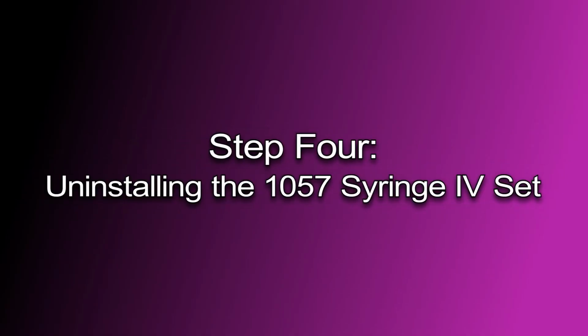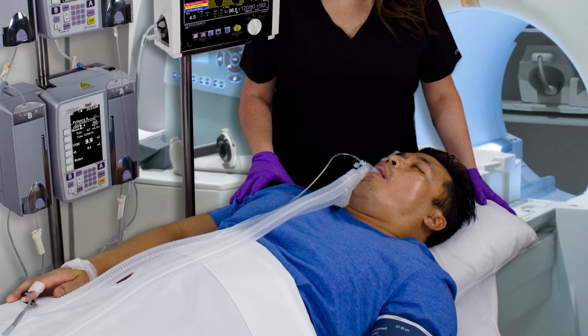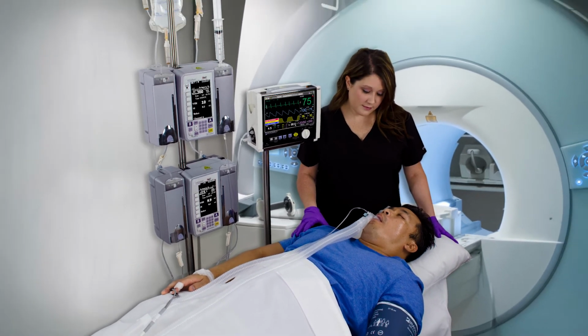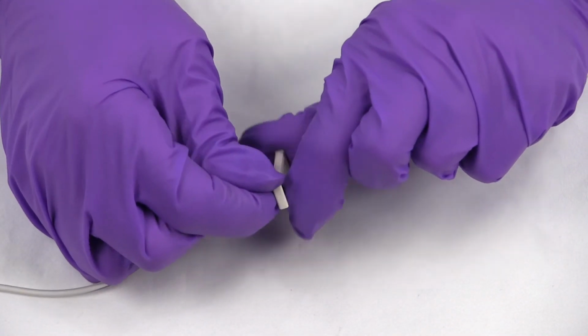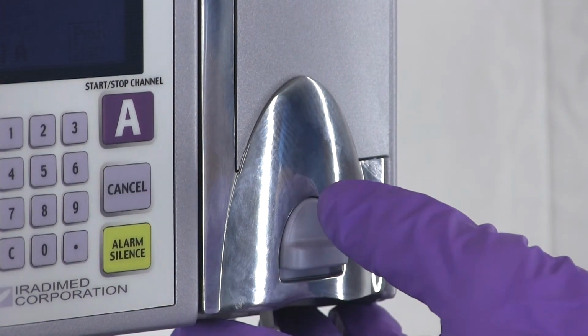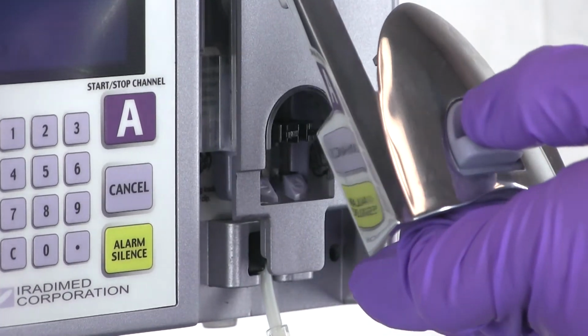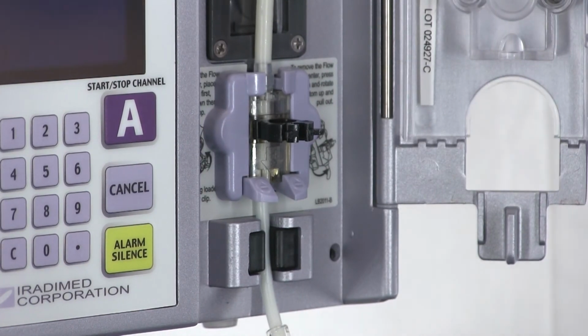Step 4. Uninstalling the 1057 syringe IV set. Once the infusion or the patient's MRI exam is complete, the user will disconnect the IV infusion set from the pump. First, the user will close the slide clamps or roller clamps to prevent free flow. The user will then open the pump's door. It is important to remember, as the door opens, it will automatically clamp off the flow preventer, which accounts for the initial resistance the user feels upon opening.